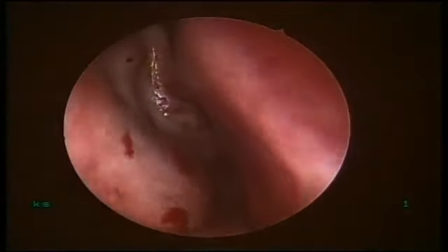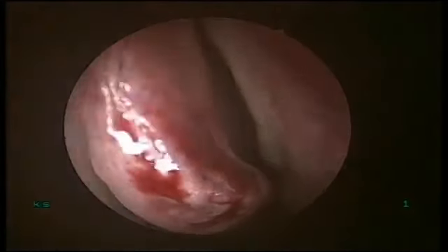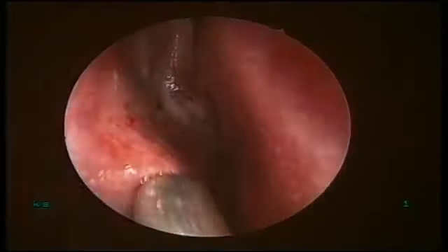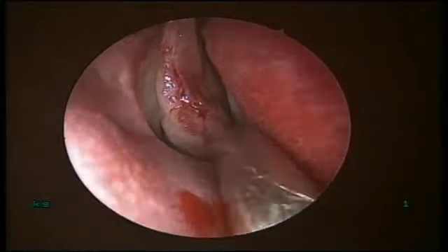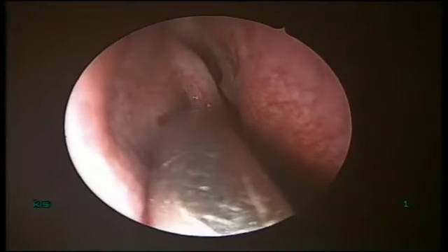So the area of interest is this anterior part of the nose. Now there are certain landmarks which you can see at this point which are important. This is the middle turbinate, and see the uncinate process behind in the middle meatus. This is the inferior turbinate, and this prominence anterior to the middle turbinate going up belongs to the nasolacrimal system.